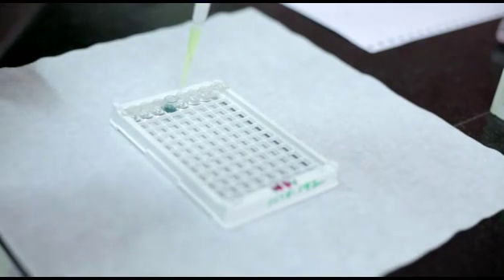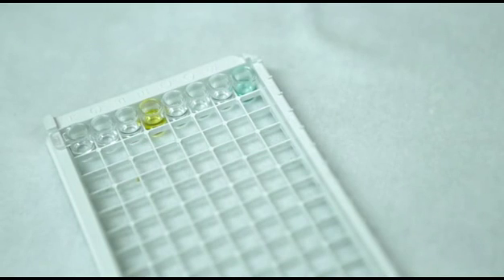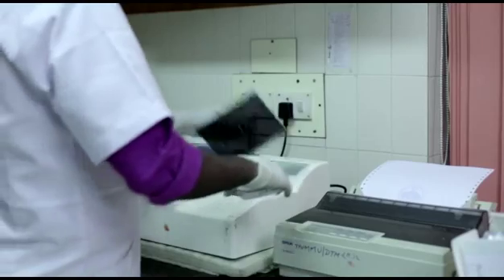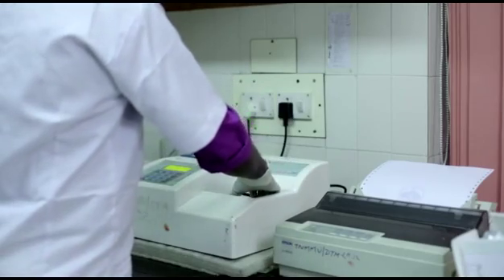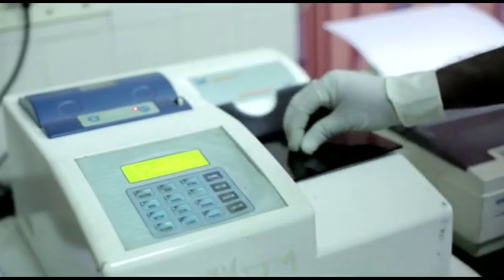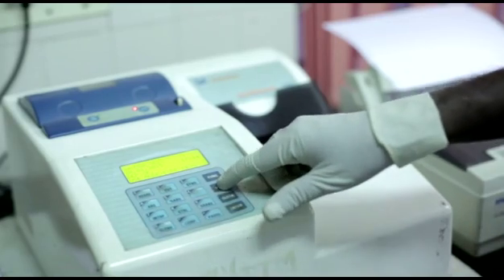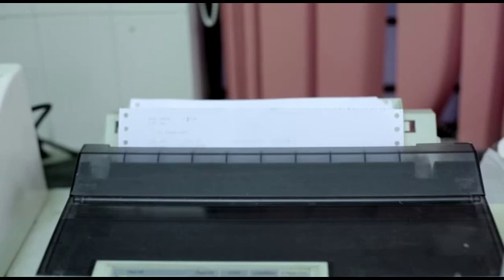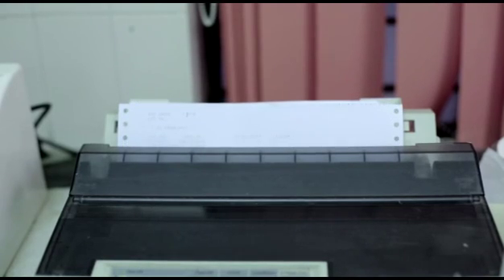Add stop solution to fix the color developed in the wells. Ensure that the blank well is negative. If not, the test is invalid. Results must be read immediately using the ELISA reader. A printout showing the absorbance values for the samples in the microplate is obtained.